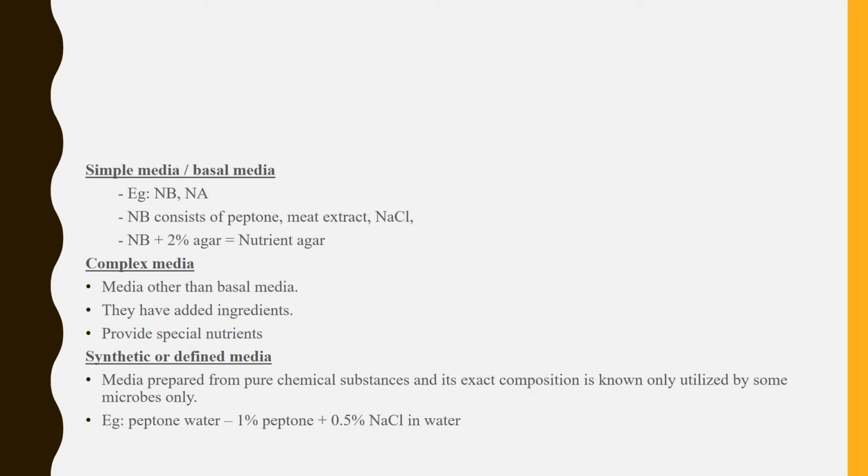Third is synthetic media or defined medium. It is a media prepared from the pure chemical substances, and its exact composition is known, and it is only utilized by some microbes. Example is peptone water, in which 1% peptone and 0.5% NaCl is mixed into the distilled water.